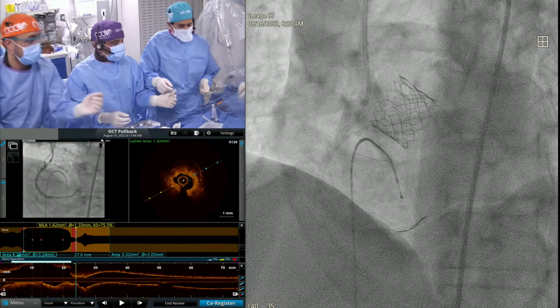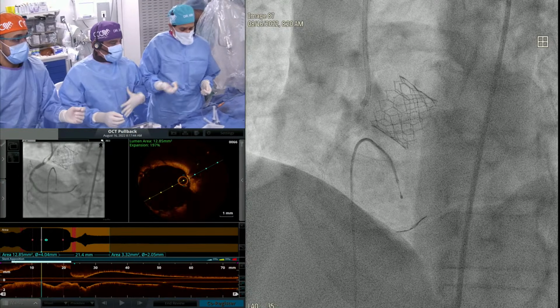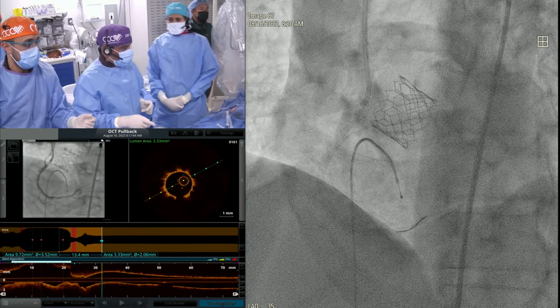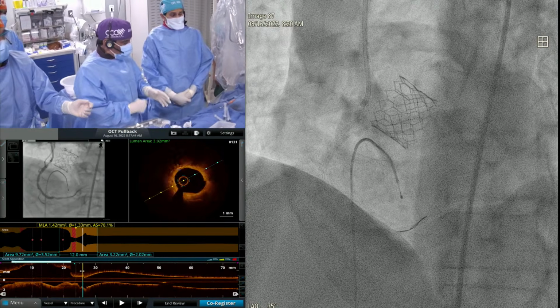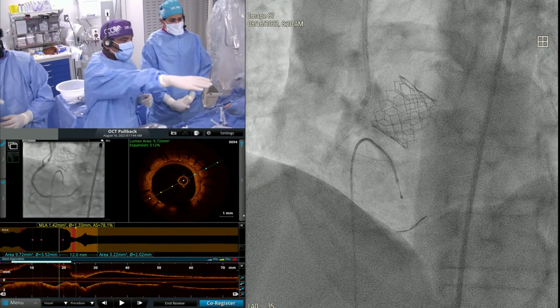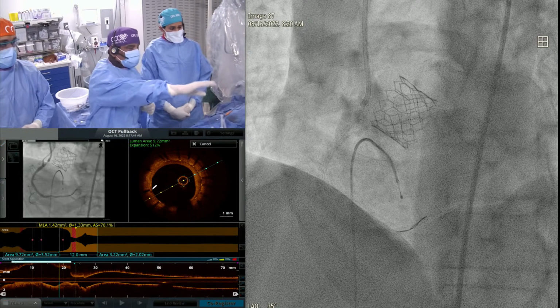Okay. So the question is, based on what we learned now, do we need to do IVL or not? Whatever discussion we have, we can keep very clear cut. No, but move him out, help him out, please. The guy is going to contaminate everything. Move the camera.